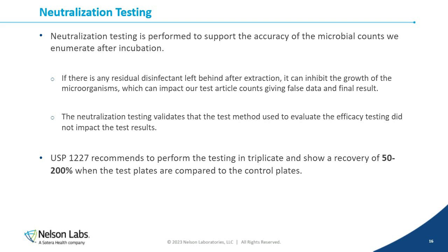The reason why this is so important is because any disinfectant residuals that may be left on the device can inhibit growth during the incubation of the microorganisms, which can impact the test article counts and would essentially give false data and an inaccurate final result.